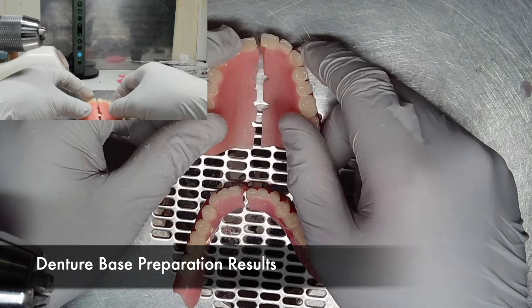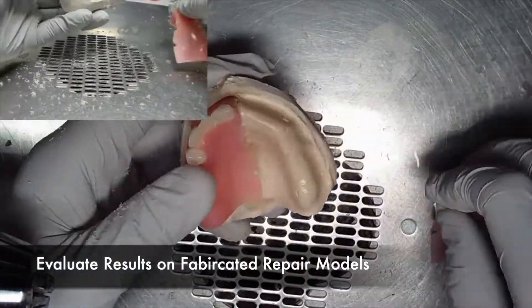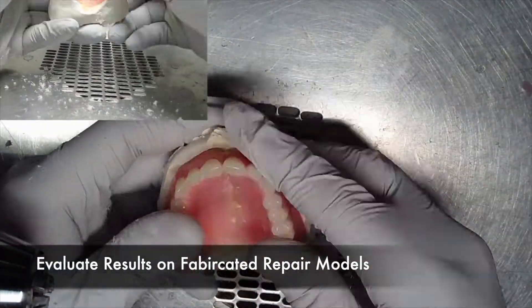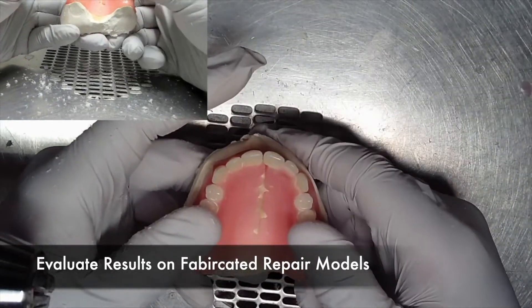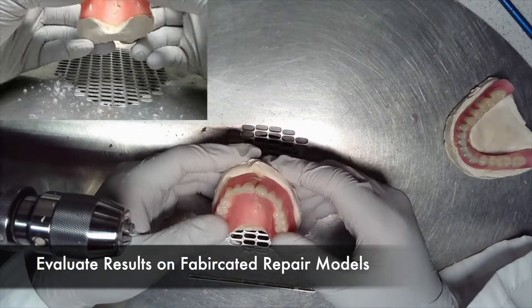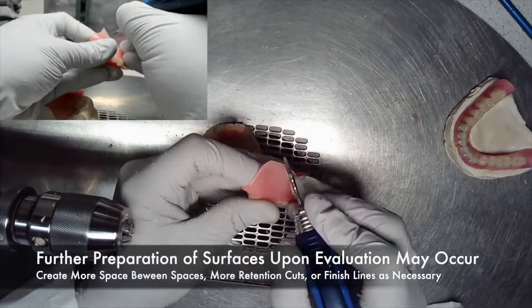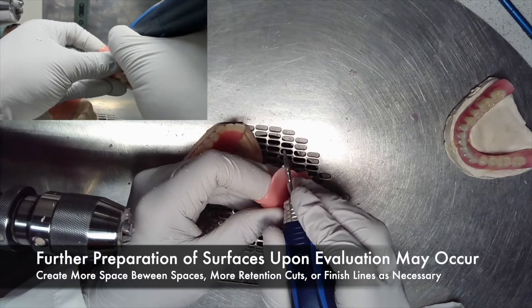The results of a denture base preparation for a fracture repair are as shown. It is important that the results are evaluated on the fabricated repair model. By putting it on the model, it will show if there is enough space between the two parts and if your retention cuts are large enough. If not, make further adjustments to both sides of the repair.